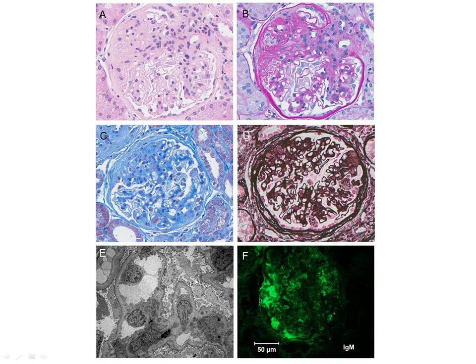So we have effacement of foot processes. You have these little tiny tendrils here, which is microvillus transformation. It's just what the podocyte does when it's injured. It makes little villi and sends them out everywhere. And then if you notice, the glomerular basement membrane does not have any evidence of electron-dense deposits.